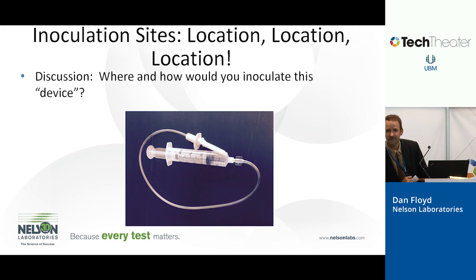Sorry? Yep, where the plunger is, that's a mated surface there. You also have, in the barrel of the syringe itself, the gas has got to get all the way down there. That cap on the end, whether it's vented or non-vented, could be a big deal. If it's vented, it's going to allow the gas to get into that more easily than if it's non-vented. If that's a non-vented cap, then the gas is actually going to have to penetrate through the walls of the syringe or the tubing or the backside of that plunger to get in there.